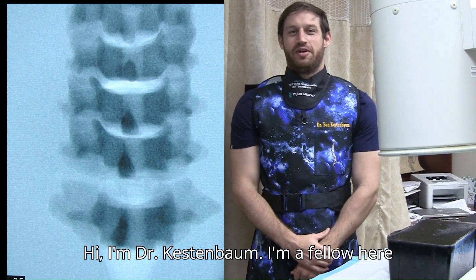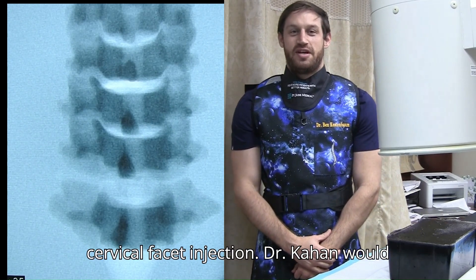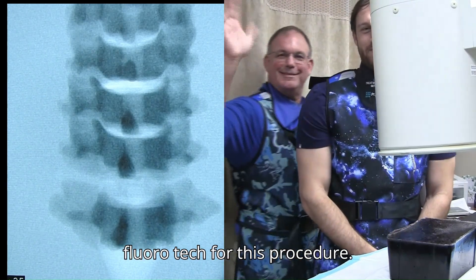Hi, I'm Dr. Kestenbaum, I'm a fellow here at the Kahan Center and today I'm going to be showing you all how to do a cervical facet injection. Dr. Kahan would be so kind — he's actually going to be my fluorotech for this procedure.